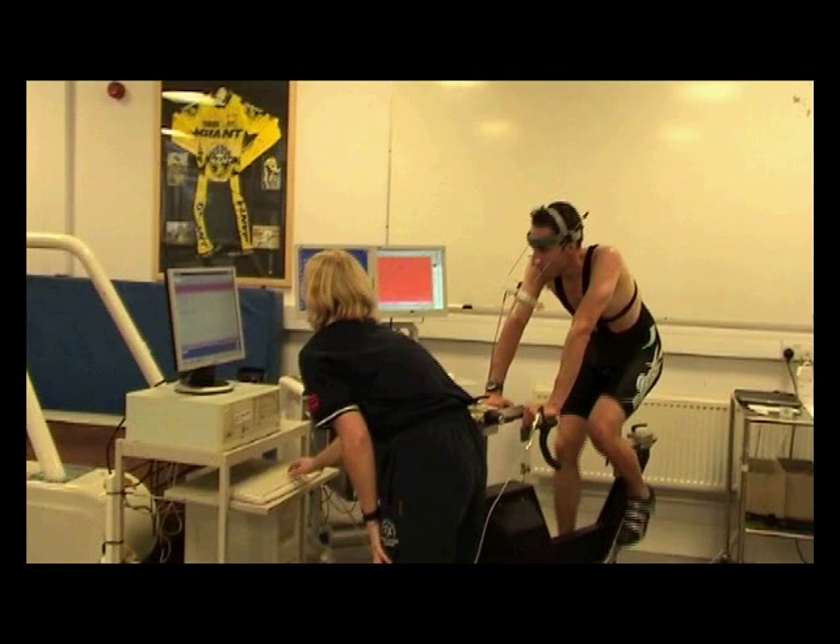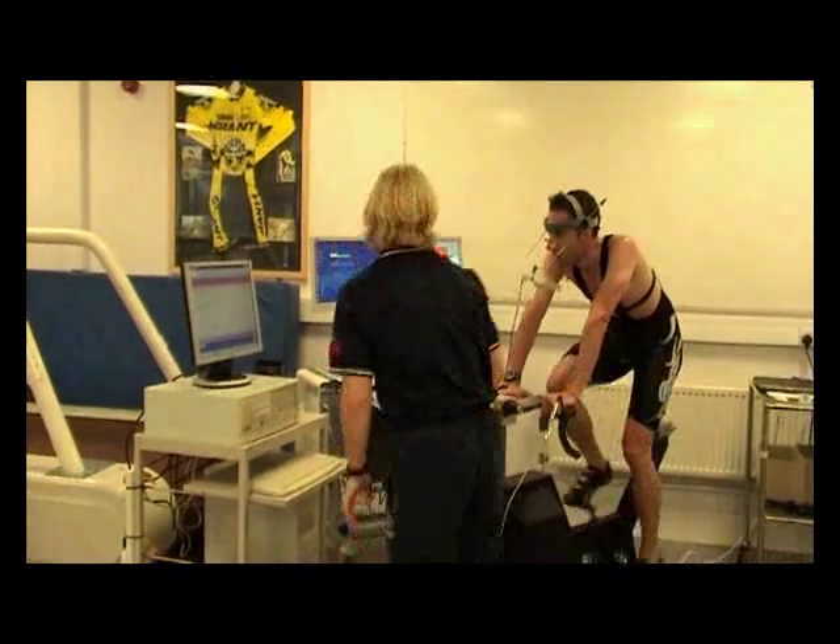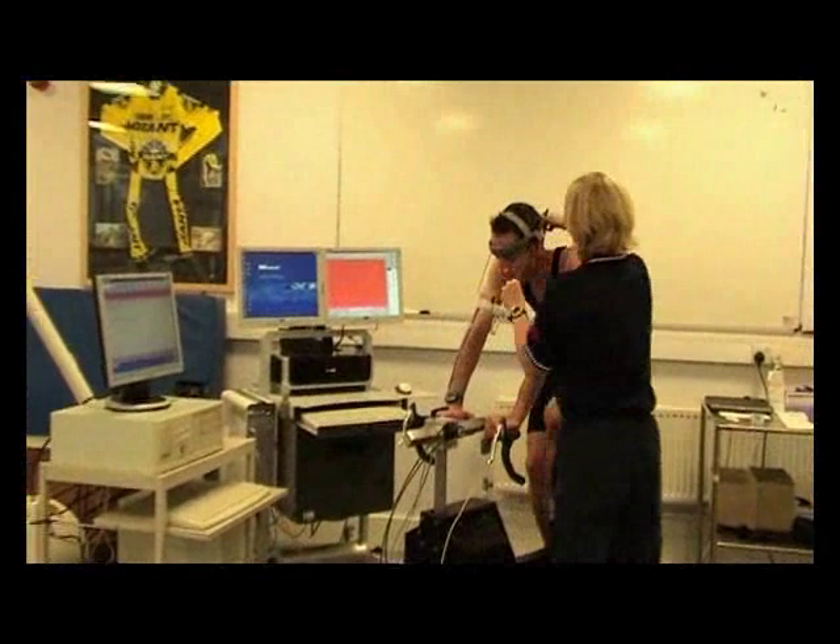This screenshot is taken from the download of the SRM ergometer after the test is finished. Heart rate is in red and power is at the bottom of the screen in green — you can see both increasing throughout the test. This also shows nicely how we calculate the maximum minute power, taking the last minute of the test: 402 watts. Good score and a good test.